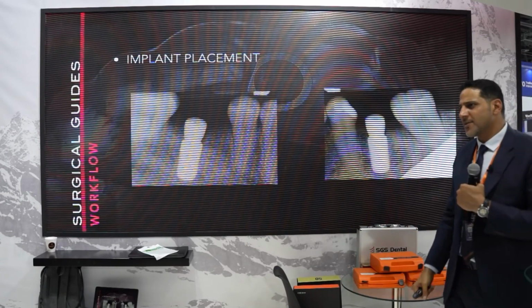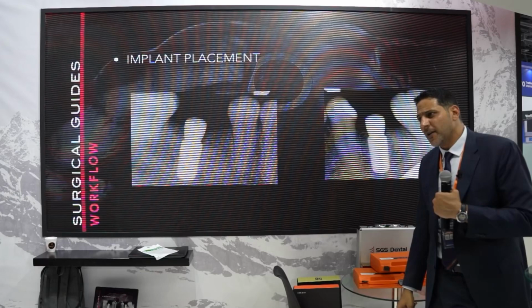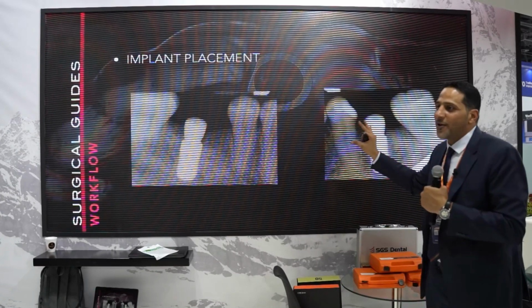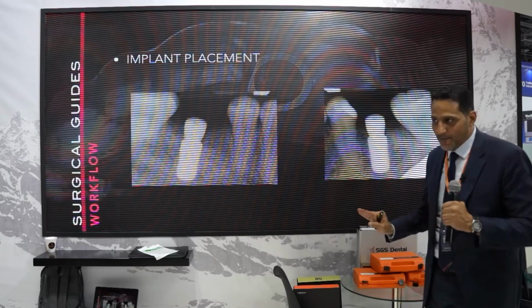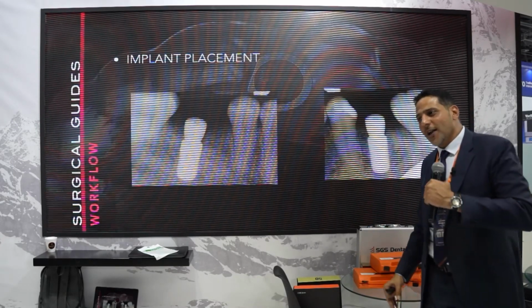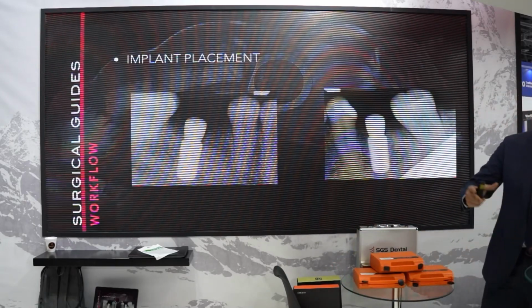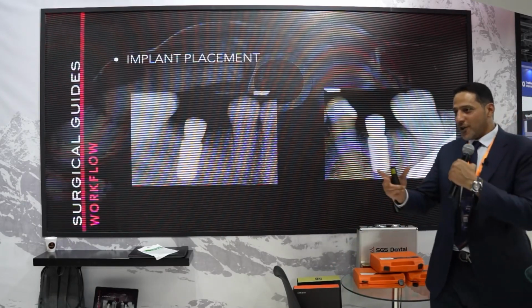For the closed system, can you use SGS for it? SGS implant? No. It is only for the closed system. Is there no workaround? Well, the Arab way, we can find one. But like now, most of the systems are open. Most of the software are open.